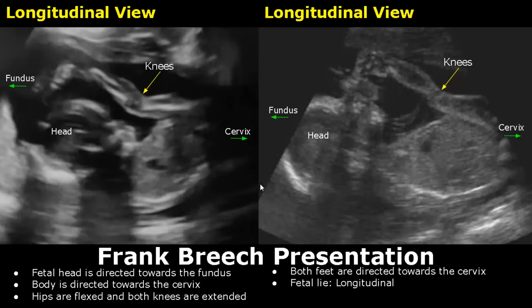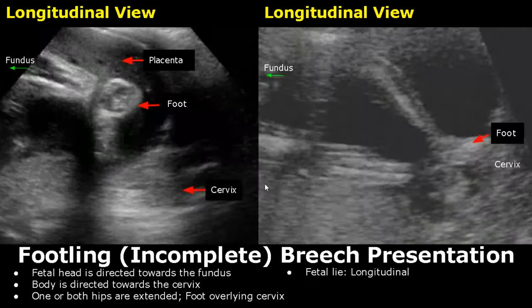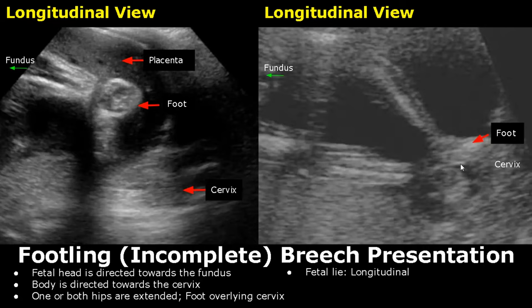In a footling or incomplete breech presentation, one foot is directed towards the cervix. One or both hips will be extended, but mainly we will see a foot right next to the cervix.